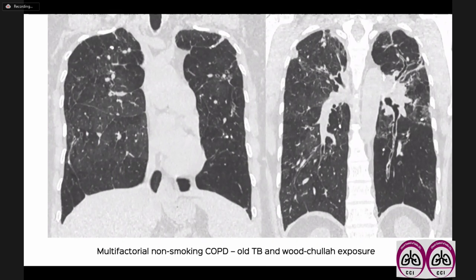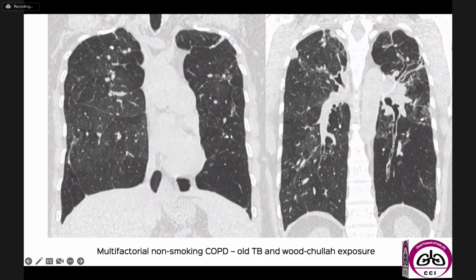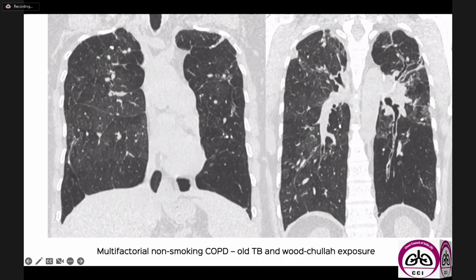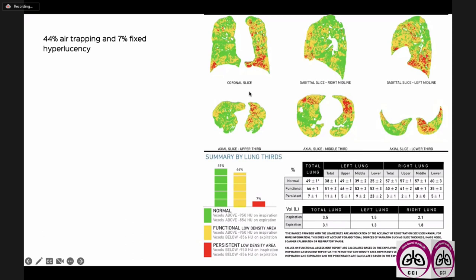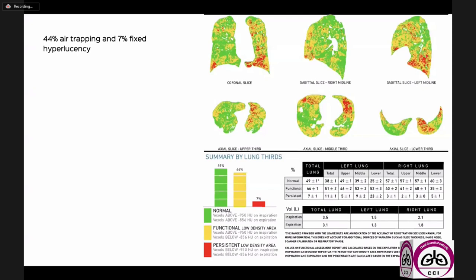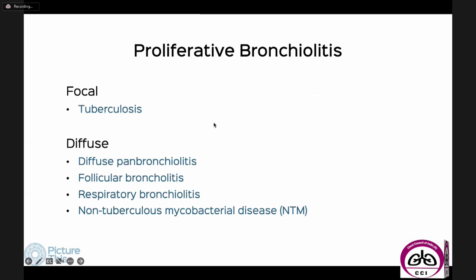In practice you may see multifactorial involvement. This patient has post-TB changes in the upper lobes plus woodfuel exposure, with lower lobe overinflation and air trapping on expiratory images — multifactorial non-smoking COPD, not uncommon in women and in our country. We've quantified seven percent fixed hyperlucency and 44 percent air trapping. The prognostic implications are not yet certain, but we are tracking these patients on follow-up to see if this correlates with improvement.